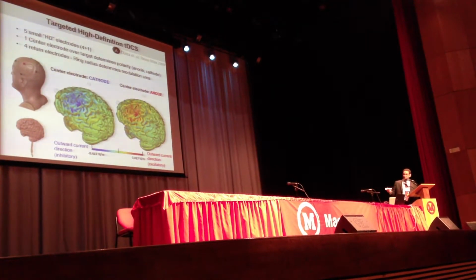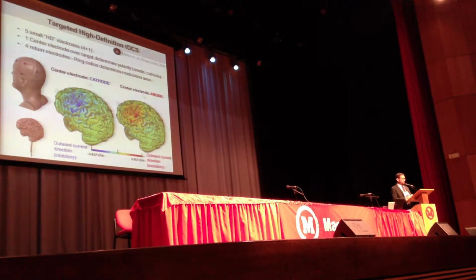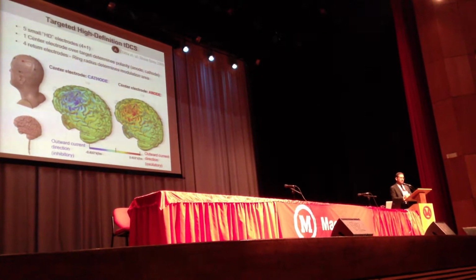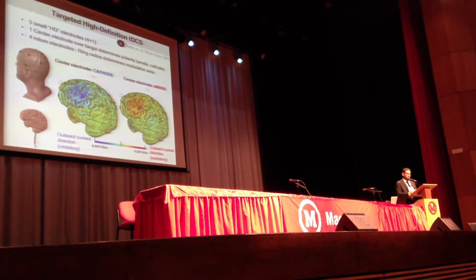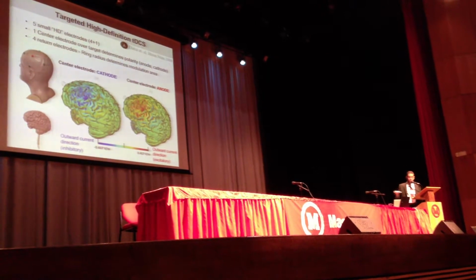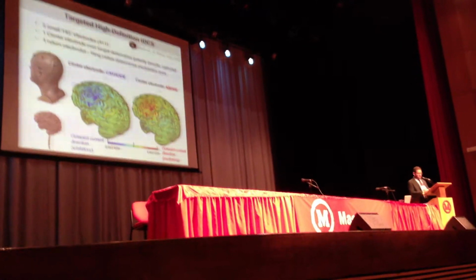The other nice thing about this montage, according to the modeling predictions, is that it produces rather unique directional modulation. Often with tDCS, you have an anode and a cathode, and you're trying to balance out these issues of excitation and inhibition. Certainly Dr. Nitsche showed many ways to deal with that. One of them is to use this montage, which produces largely unidirectional current flow. So if you just want to produce excitation, you would use a center anode.